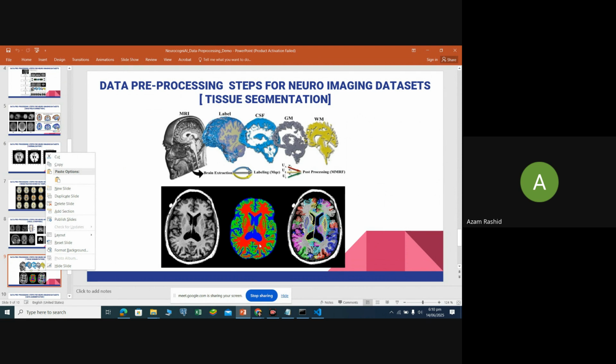And in the next modeling phase, we also apply some prediction, and after the prediction, we explain over all the MRI slices in an explainable AI format. Now the tissue segmentation is the basic segmentation area from which we extract the major features regarding the MRI pre-processing.